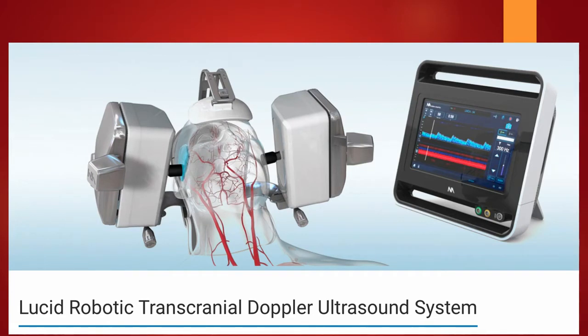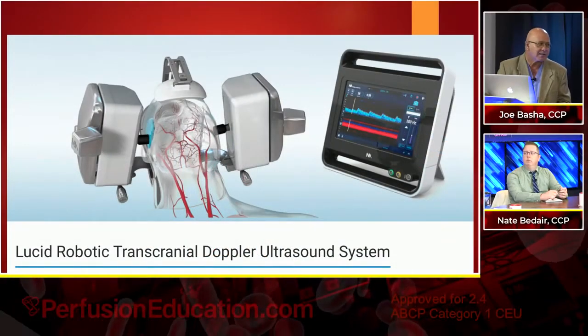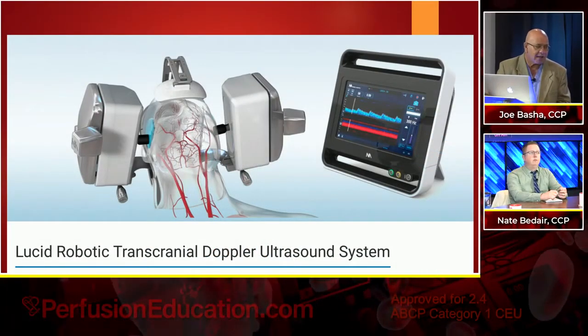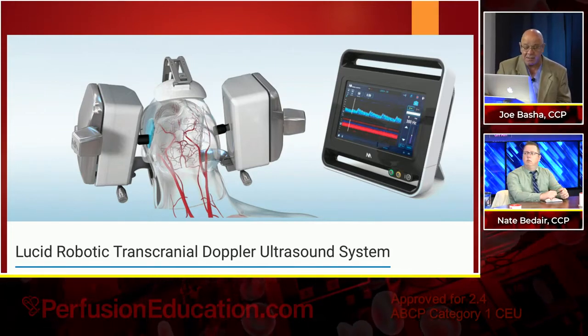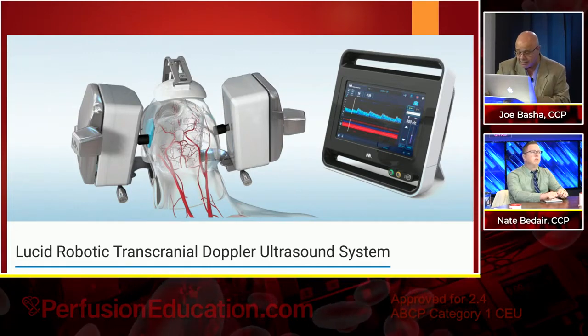That's going to be in the way of anesthesia. Absolutely. For this to be adopted into routine cardiac surgery, it's going to require being a whole lot smaller, and a whole lot easier to use. Right away, I think that's the issue that I have with it. But I think it's brilliant, and I think it needs to be done.